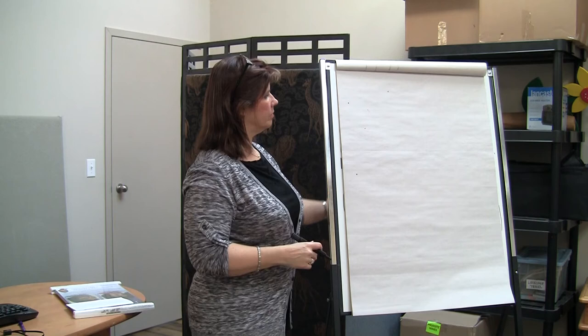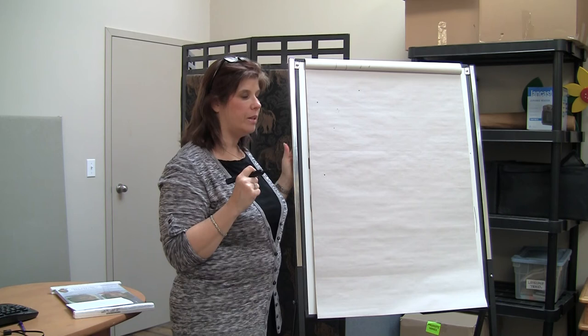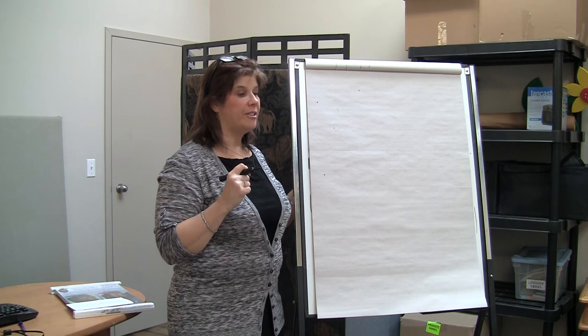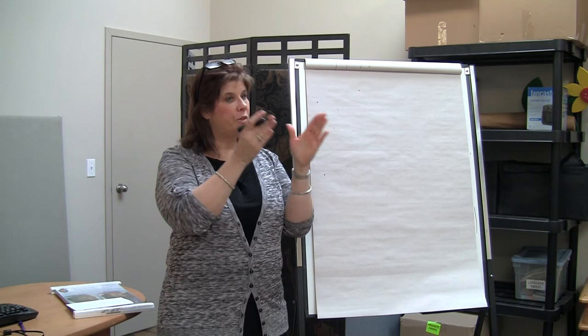Okay. So there's going to be a lot more Botox time. But I wanted to give you a little bit of an introduction on how to do fillers. So let's talk about fillers. The thing to know about fillers is that, like I said, there's a thin, a medium, and a thick product. And then there's superficial, medium, and deep injections.